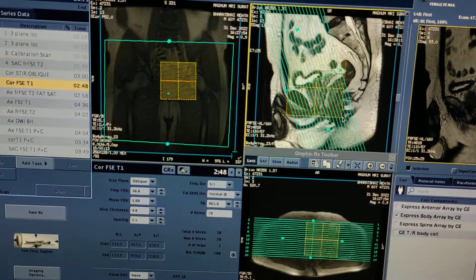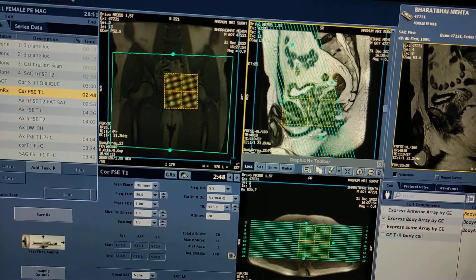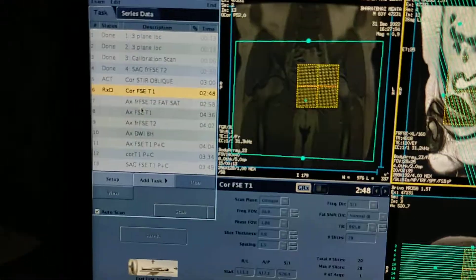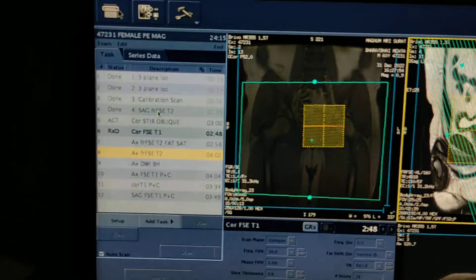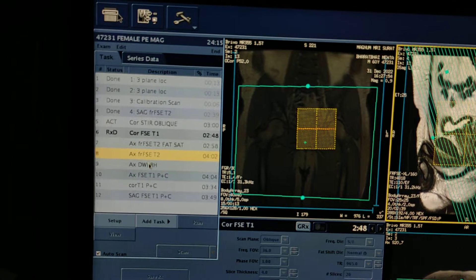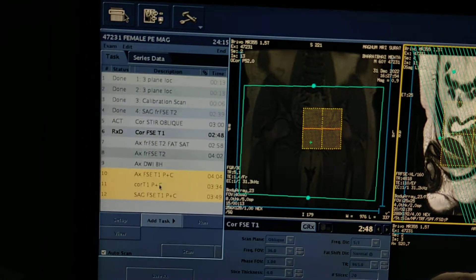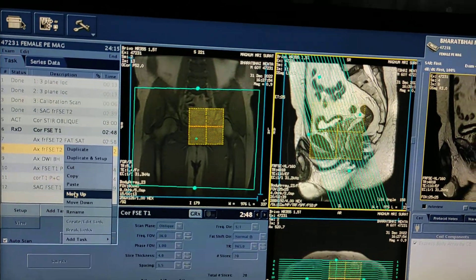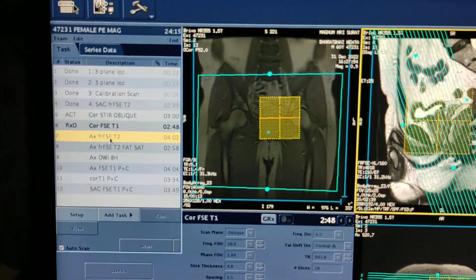Coronal T1 is also planned. Now you have to plan axial. My protocol is: sagittal T2, coronal STIR, coronal T1, axial fat-sat T2, axial T2, axial DWI, and in three planes T1 weighted post contrast. Now I will plan axial T2 — double click on axial T2.